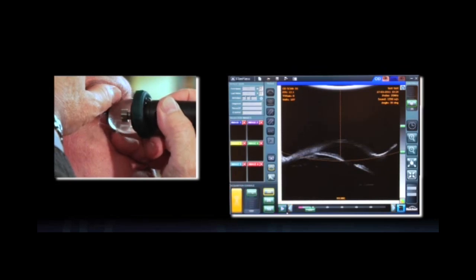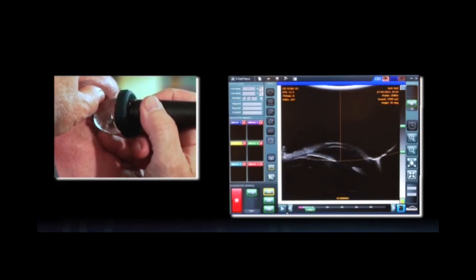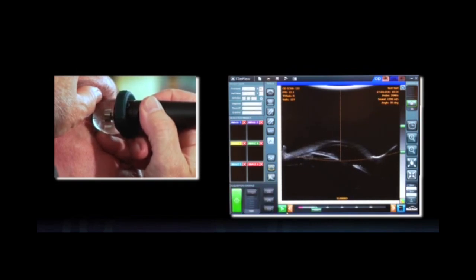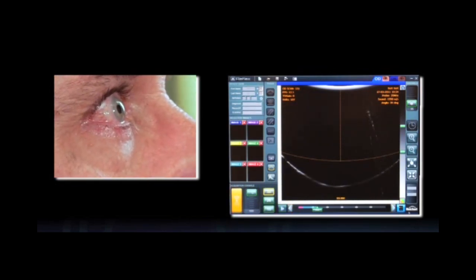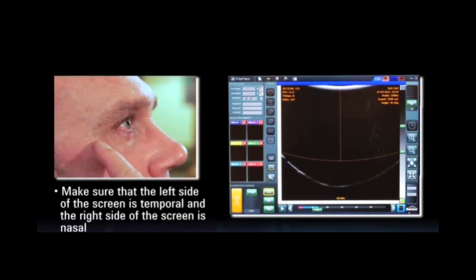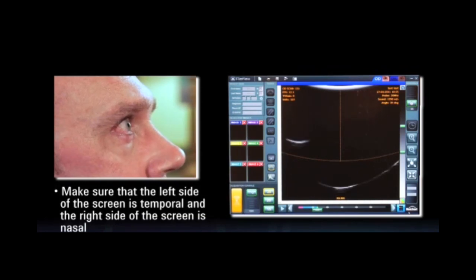Freeze that. Do that one more time. I want to freeze that. There, I'm right at the optimal spot. And I want to have the same orientation in my resultant picture as I'm looking at the patient. I want the left-hand side of my picture to be temporal. I want the right-hand side to be nasal for the right eye.